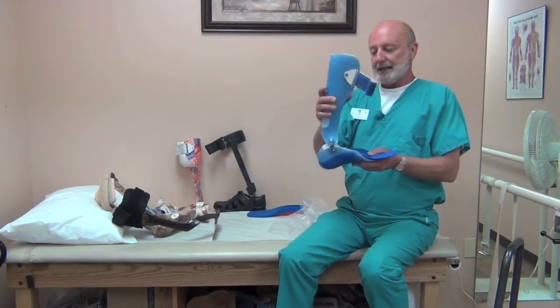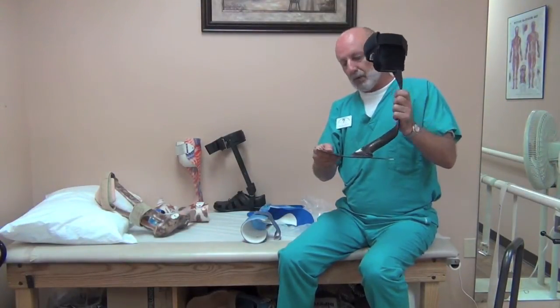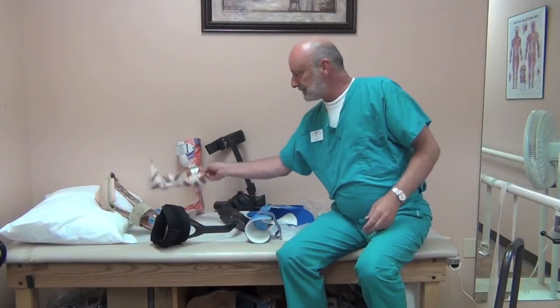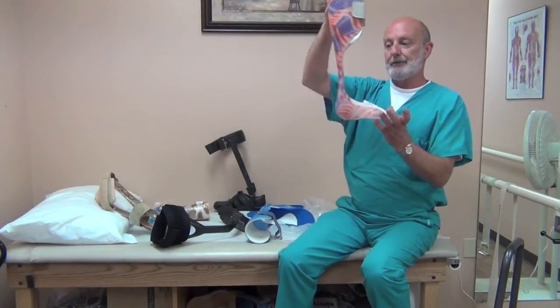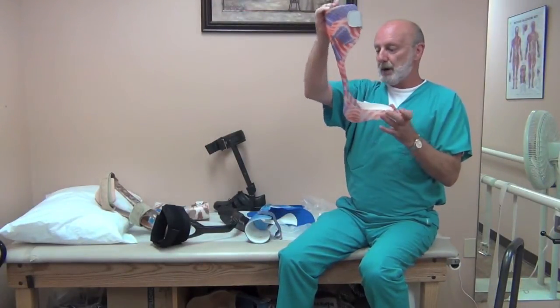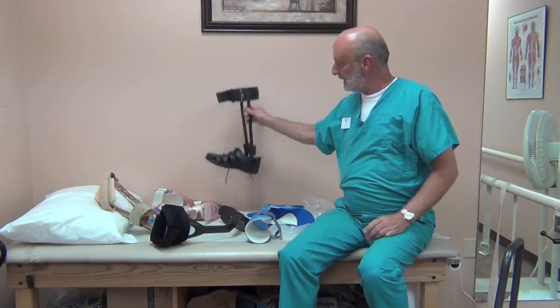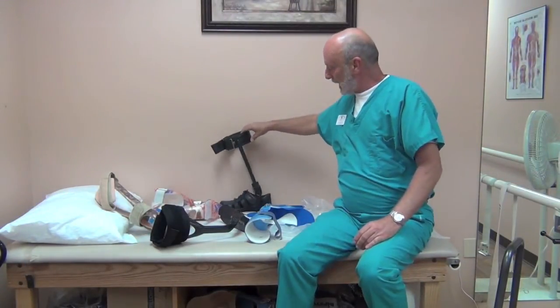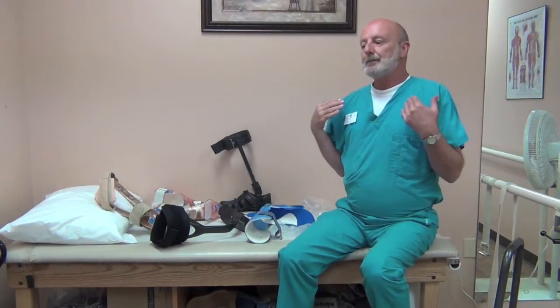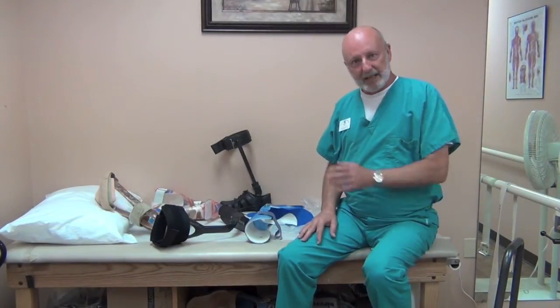So for peroneal palsy or drop foot, there are several designs to consider: the hinged AFO with full range of motion; the carbon fiber AFO, ultra-lightweight and very effective; the hinged AFO with a minor plantar flexion stop if you have issues at the knee; the leaf spring AFO that allows some motion and is very lightweight and effective; and the double upright AFO with dorsiflexion assist hinges. Those are the primary designs. If all you have is a drop foot, any of these designs should be considered, and one of them should work well for you.